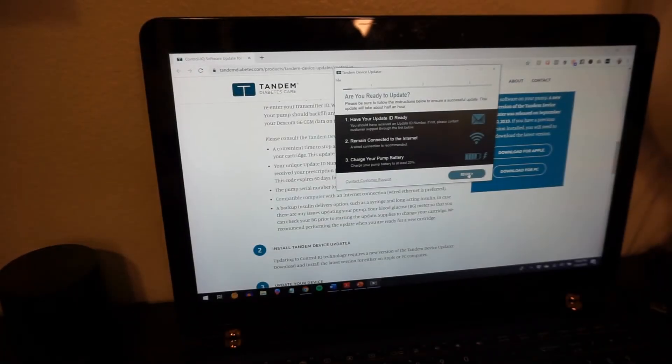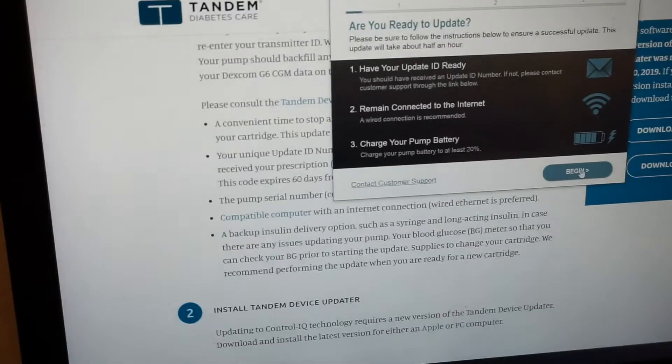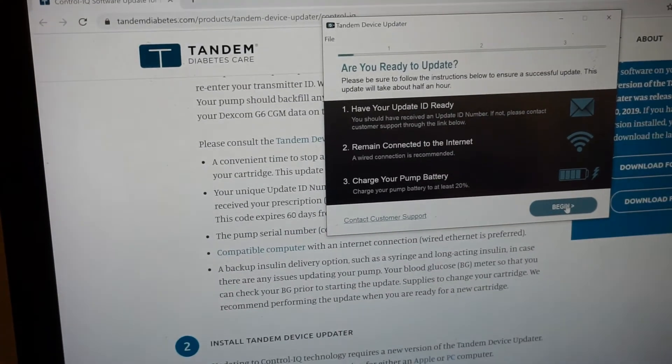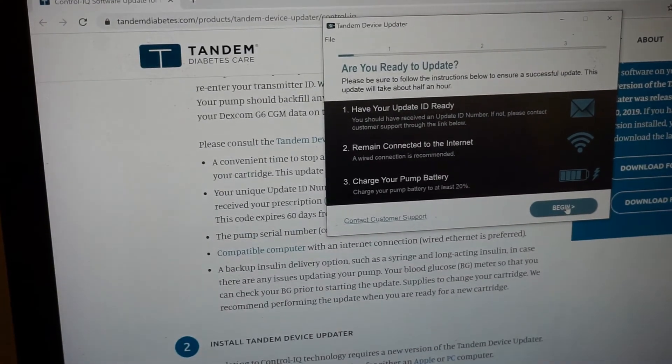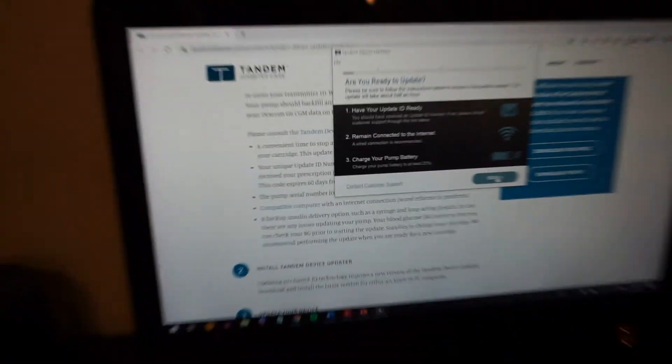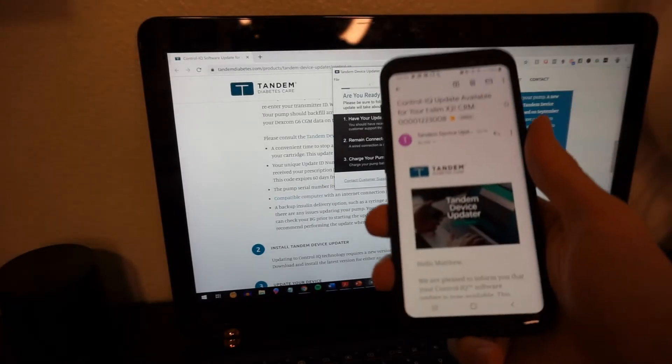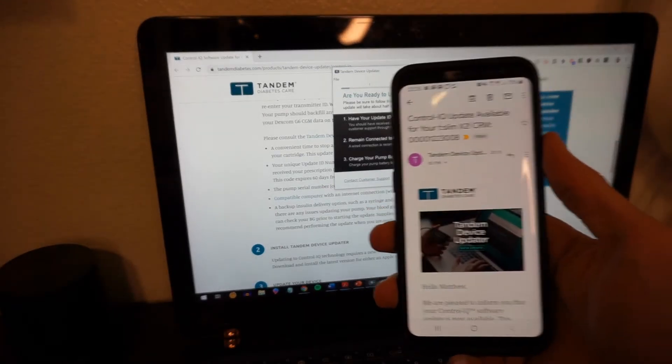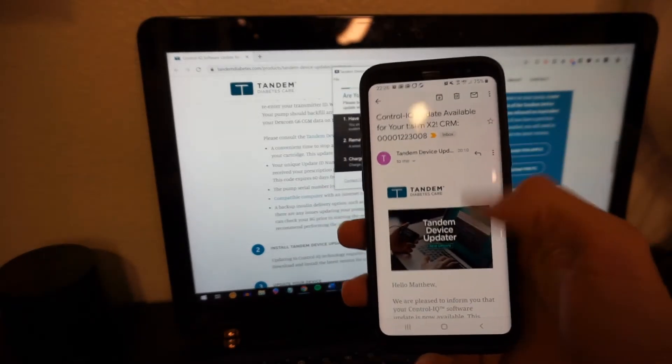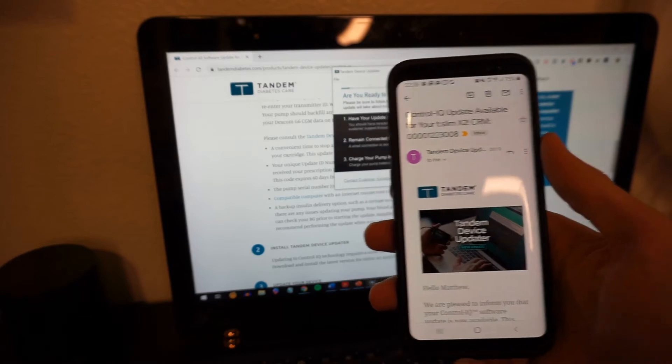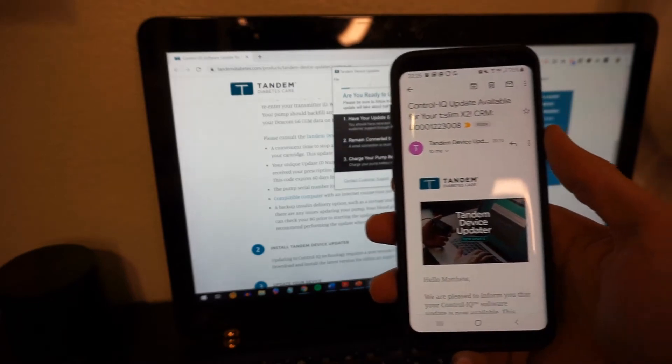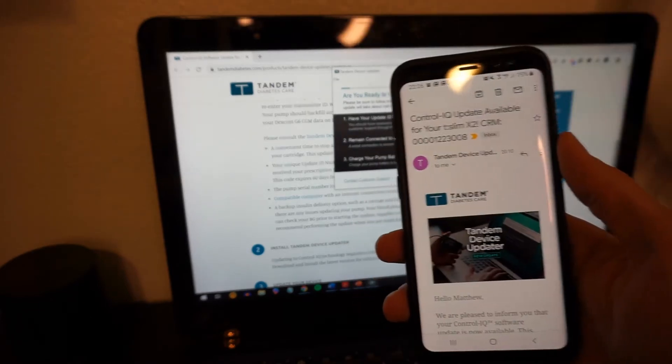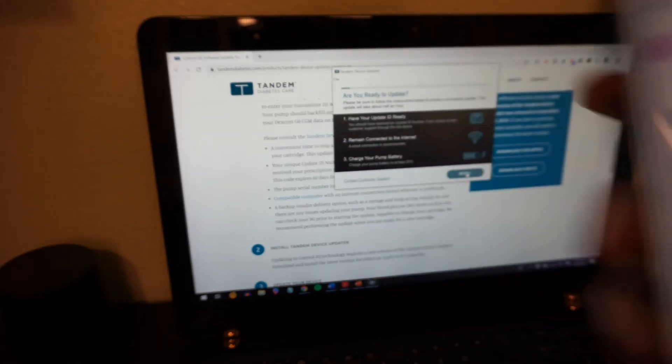Okie dokes, guys. I don't know if you can read that, but let's see if I can zoom in. Okay, have your update ID ready. Remain connected to the internet. Charge your pump battery. Make sure you have this email ready. Okay, see that? Control IQ update. It's got all my numbers in there, my pump ID, all that stuff. Have that ready because you're going to need it for this process.